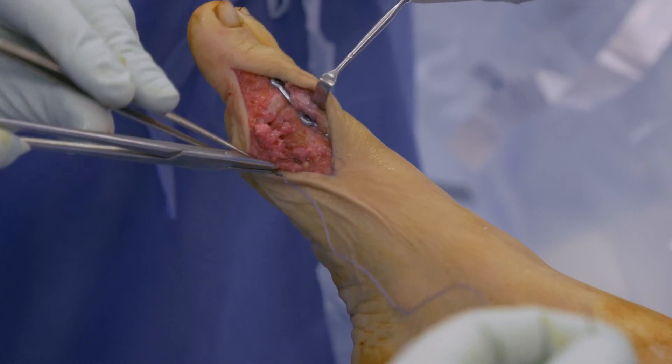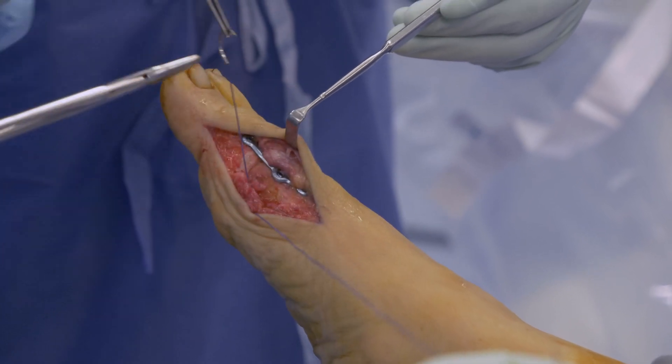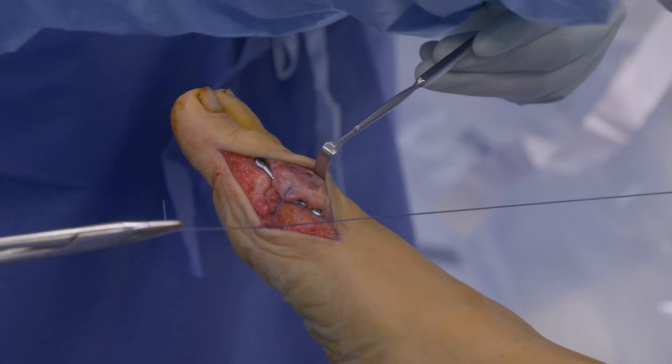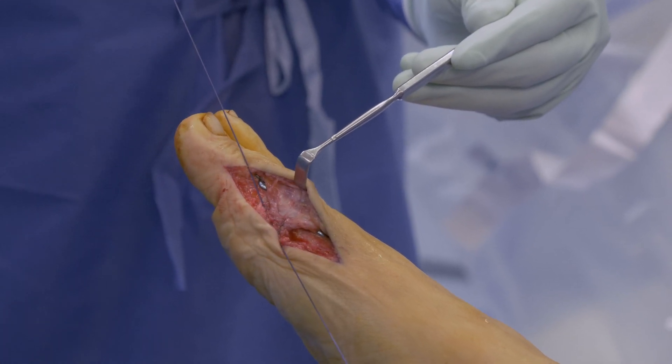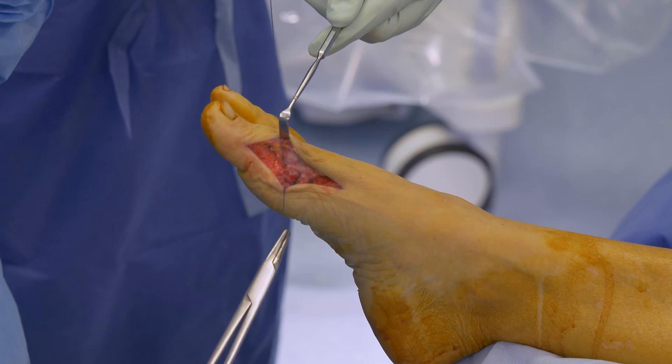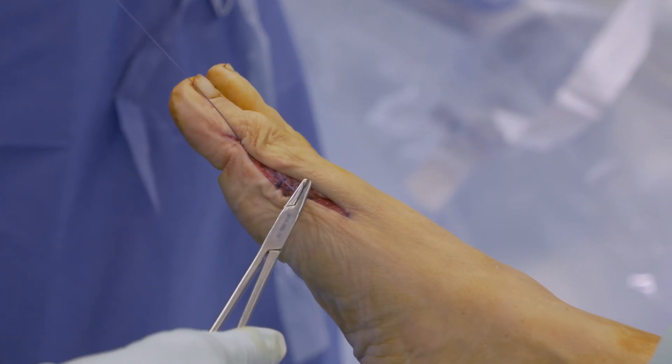Closure: After irrigation, the capsule is closed with bioresorbable vicryl sutures, taking care of the abductor hallucis tendon. Afterwards, the subcutaneous sutures are performed, and the skin is closed with single skin sutures.